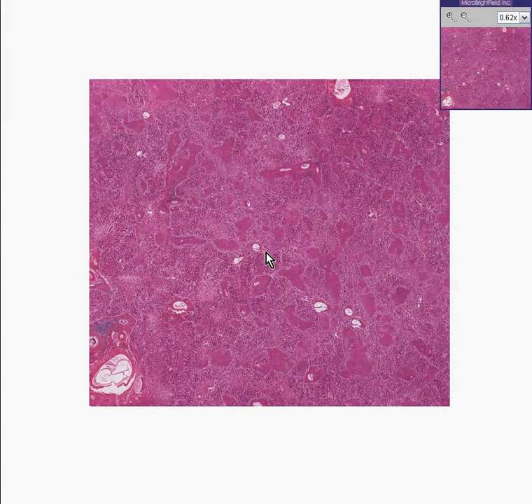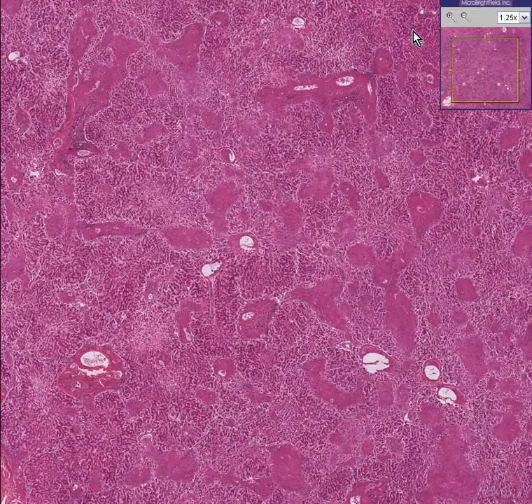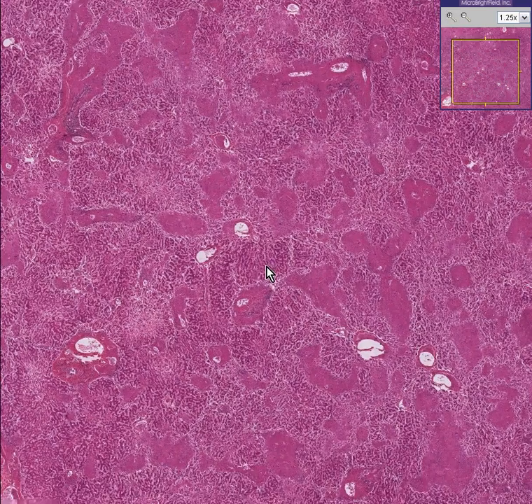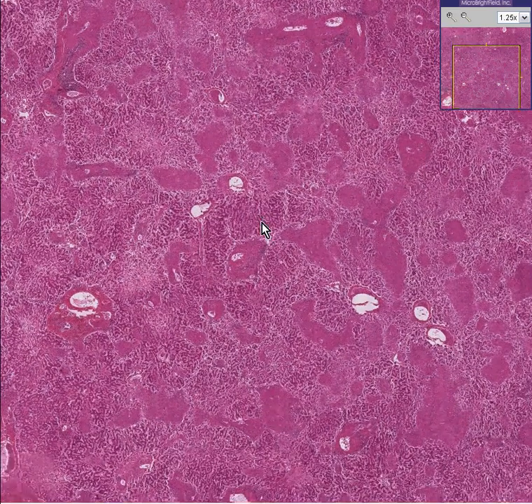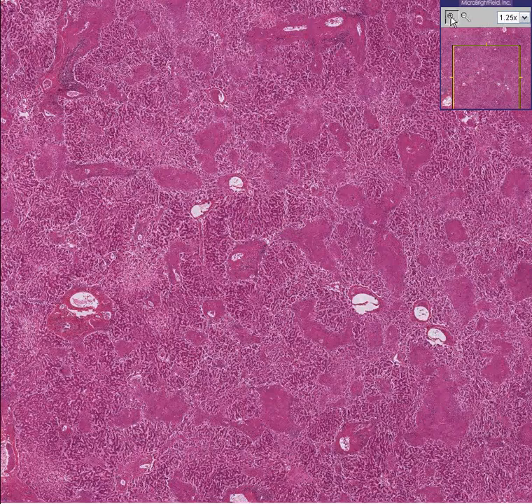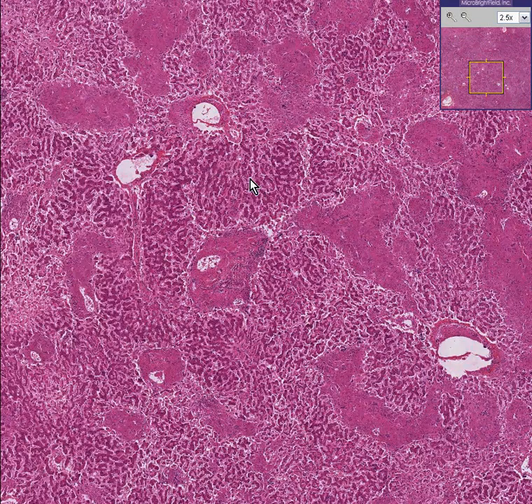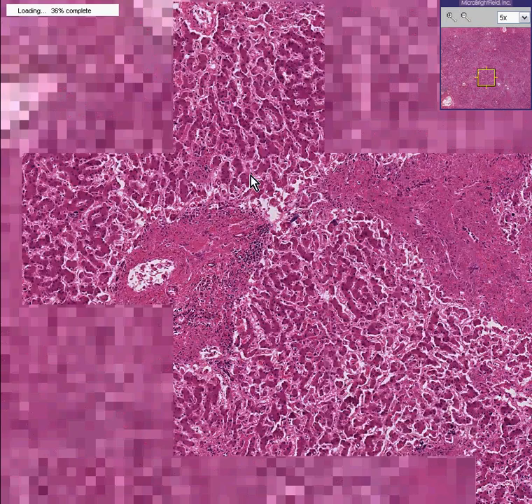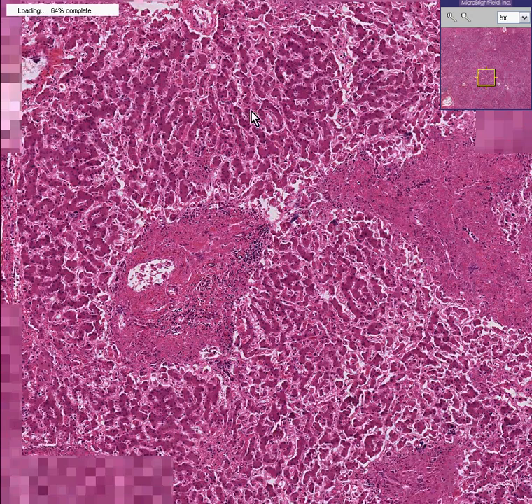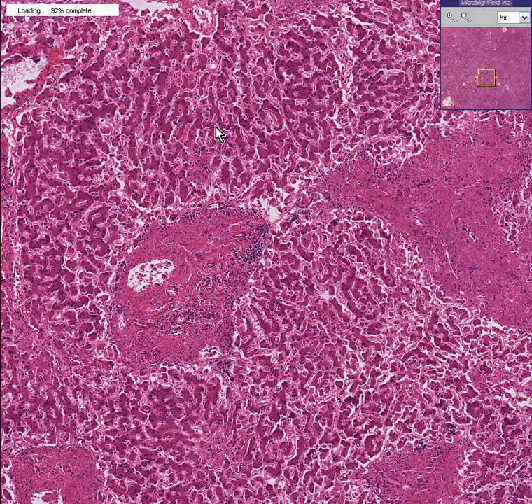My God, what do we have here? Let's take a closer look-see. And I think instantly when you see areas like this, you can recognize these as being hepatic tissue, cords, and sinusoids.